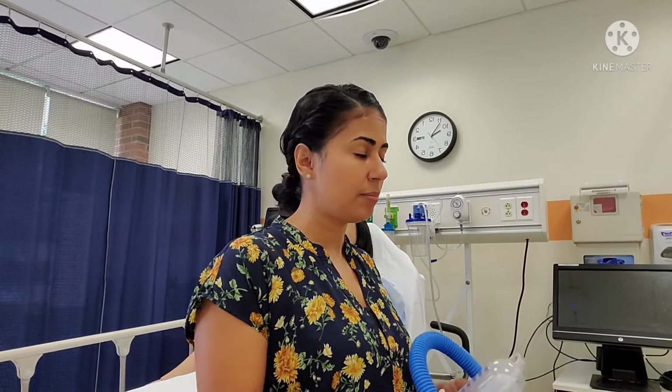So we want to encourage our patient to be sitting up in the bed. We're going to have their lips tightly wrapped around and take a nice big slow deep breath in. And I always teach my patients, think about it. Take a nice big deep breath in. Everybody, let's do it again together. And let's hold it. I want you to hold it. 1, 2, 3, and let it go nice and slow. Now I want you to take a big fast breath in.